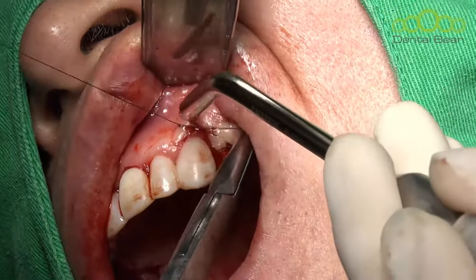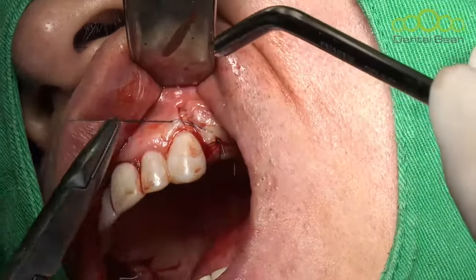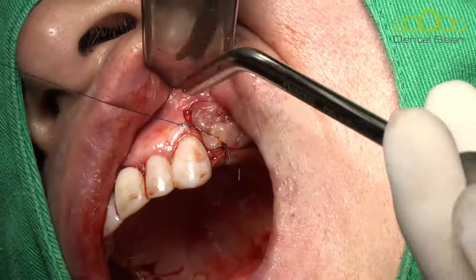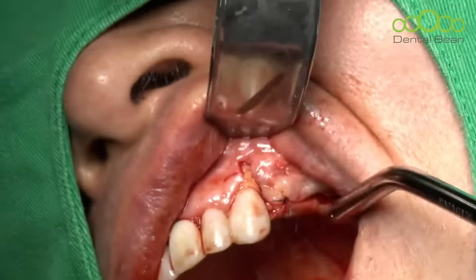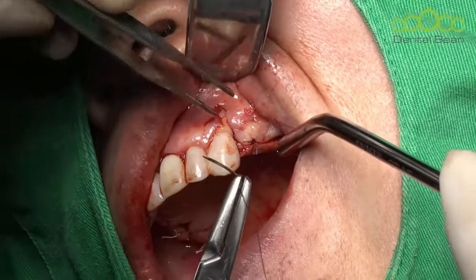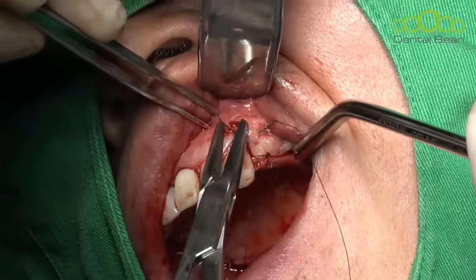In fact, I don't usually use a pencil. Just in this live case, for showing, I used the pencil. But for beginners, the pencil will be very useful to prevent mispositioning. Okay? Some dentists really like to use a pencil, but it's not my favorite.